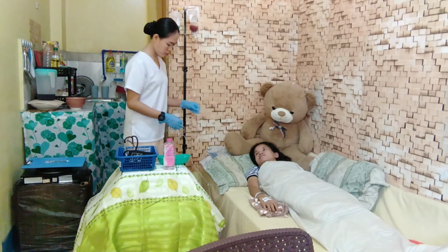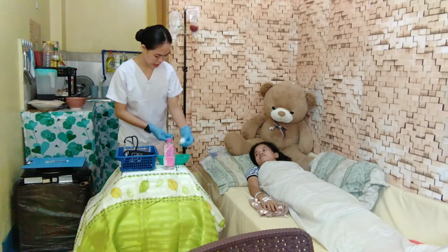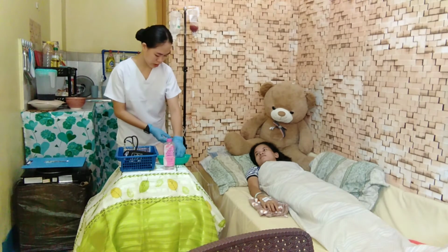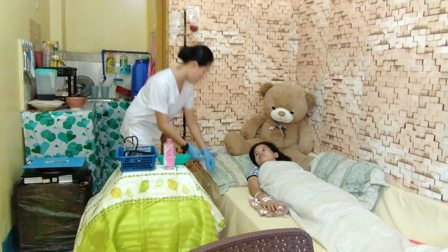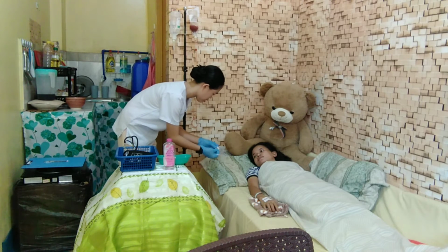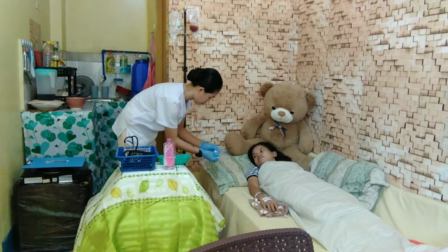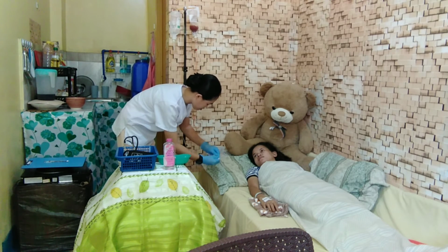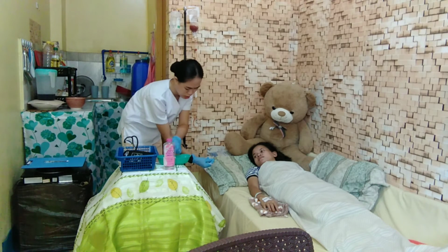We will first clean the site where the blood will be infused, to avoid transferring microorganisms and to avoid infections.